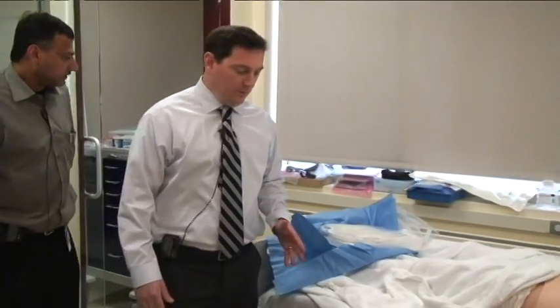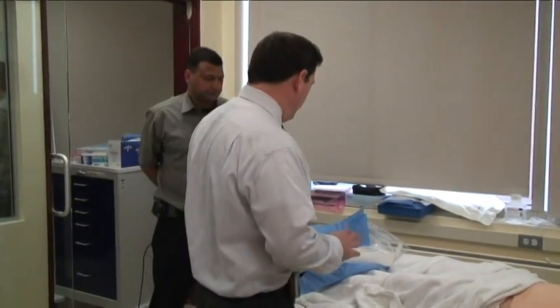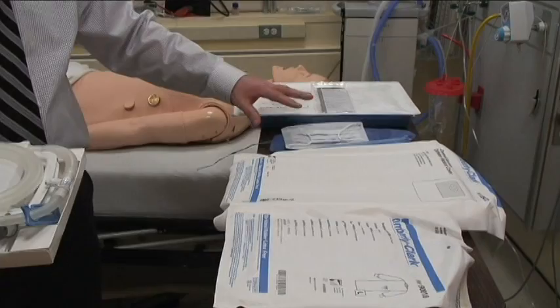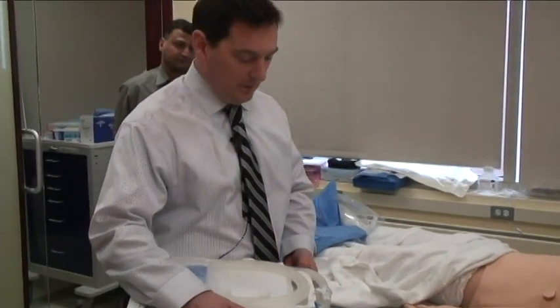Yeah, sure, thanks. With any procedure, first you have to get all your equipment together. So, you have your pleural vac, you open it up, and you can set this up. And then when we get started, we're going to do this under full sterile technique. So I've arranged here a gown and cover, as well as my kit and a hat and mask and sterile gloves. And like I said, this will be done under full sterile technique.